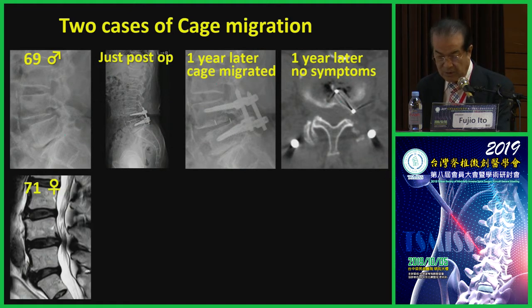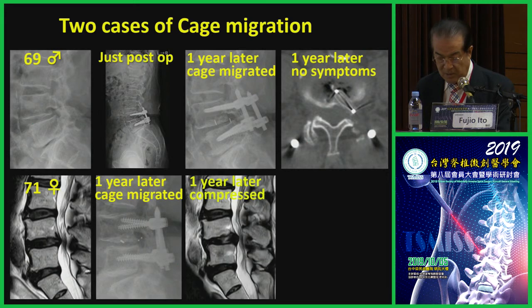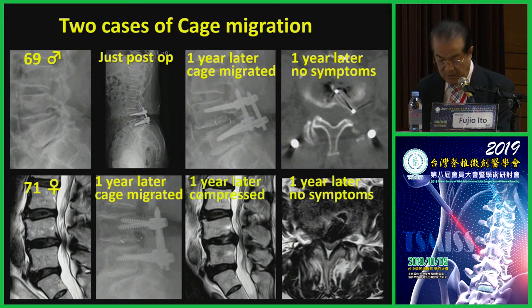The second case was a 71-year-old woman who suffered from 50-meter intermittent claudication. 1 year later, the cage had migrated toward the posterior. The spinal canal was more compressed compared with the preoperative MRI sagittal image. However, it was also lucky. She had no symptoms and could play tennis and ski.